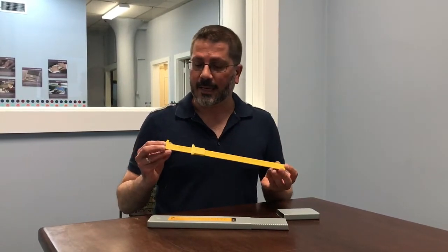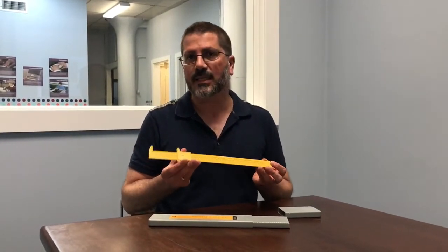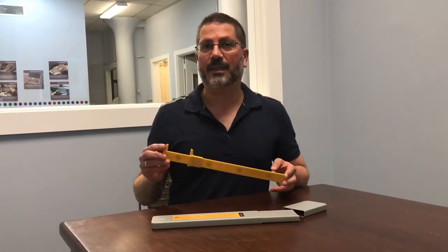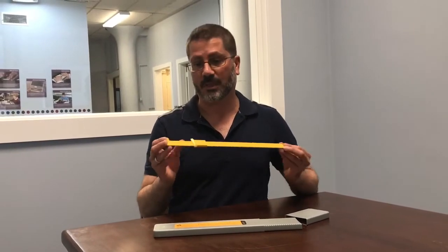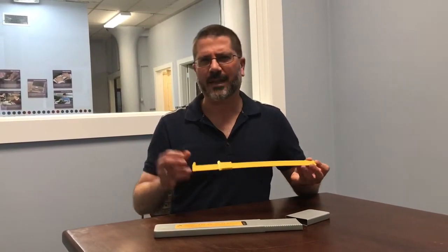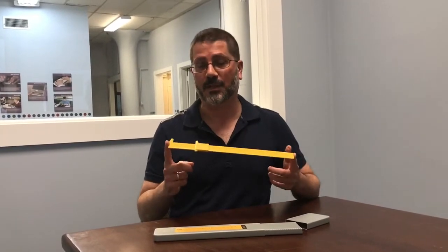It is a measuring device in inches, and it measures down to a sixteenth of an inch. When we tell people about this, they find it pretty interesting, but when we actually put it in their hands and show them how it works and how the braille refreshes, a light bulb goes off and people say that's really cool. I'm hoping today that's what we can show you.